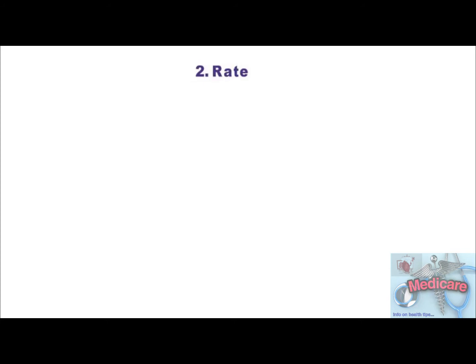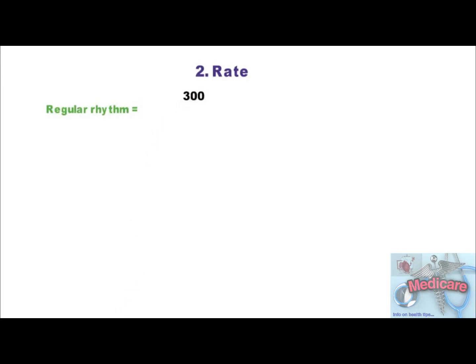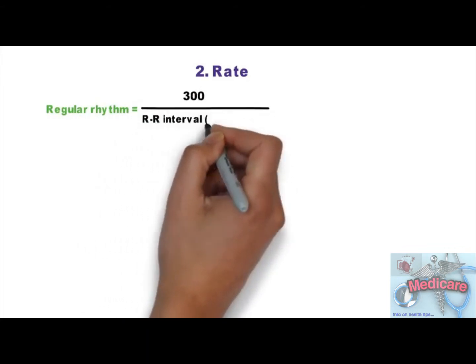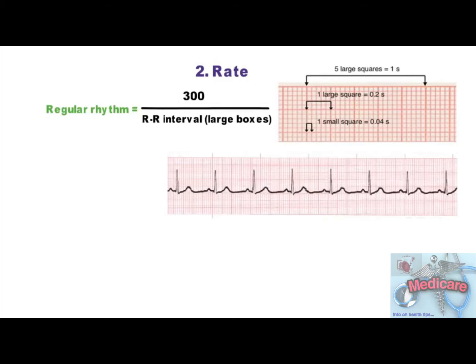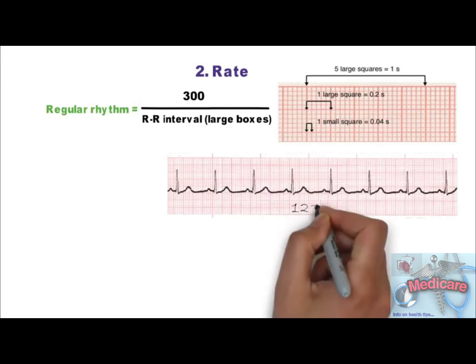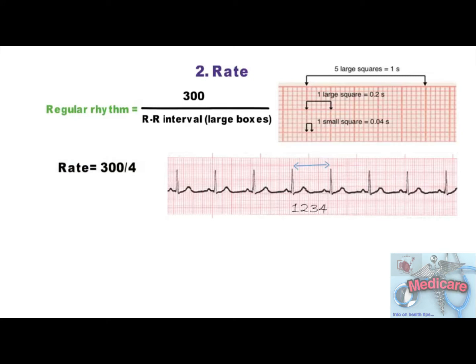Step 2 is to calculate heart rate from an ECG. If the rhythm is regular, heart rate is calculated by 300 divided by the number of large boxes between the RR interval. On ECG graph paper, if the machine speed is 25 mm per second, then 1 small square corresponds to 0.04 seconds and 1 big square to 0.2 seconds, so 5 large squares equals 1 second. In this normal sinus rhythm ECG, there are 4 large boxes between RR interval, so the rate is 300 divided by 4, which equals 75 beats per minute.